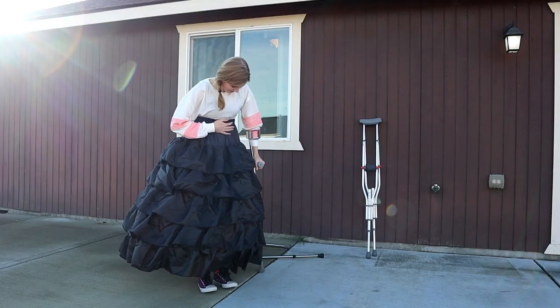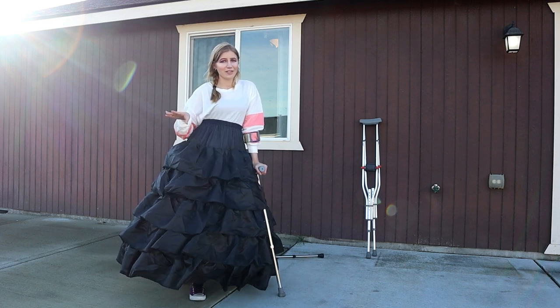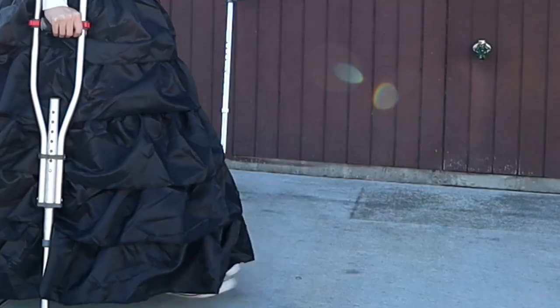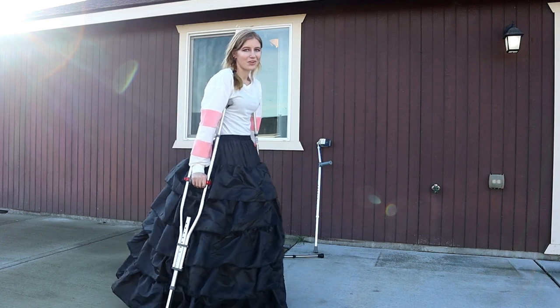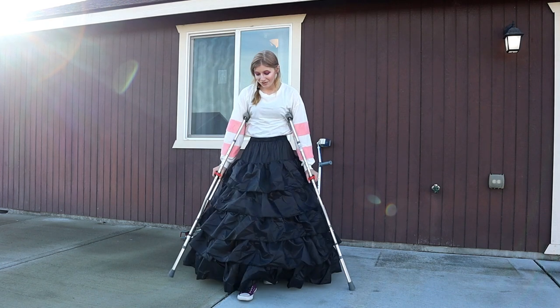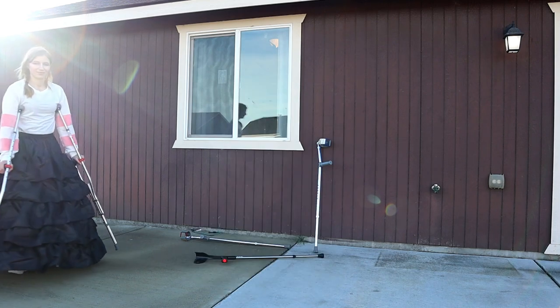Okay, so I'm going to try some underarm crutches. I pretty much never use underarm crutches because they just don't work for me, but one of my followers commented saying they use underarm crutches, so I want to include that since I have them. I have the same problem with the underarm crutches as with the forearm — having it at the normal position is just not going to work, so I'm going to have to avoid the hoops and go sideways like this. I can see this working.